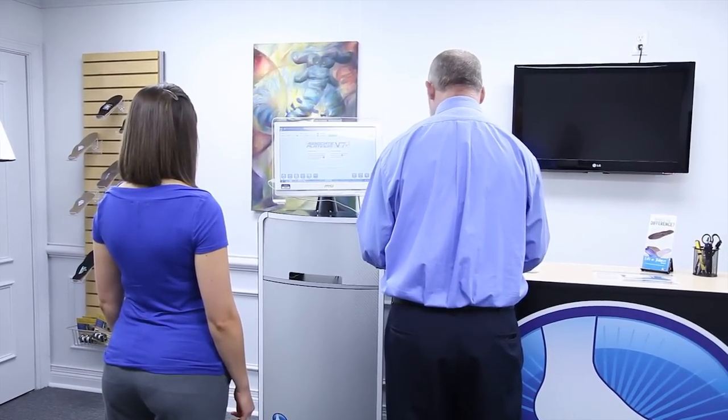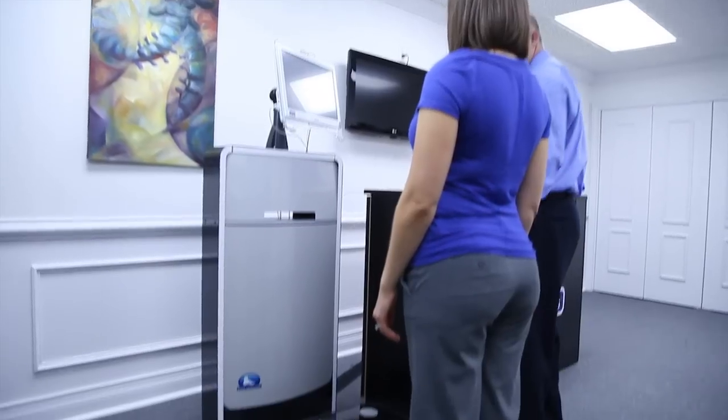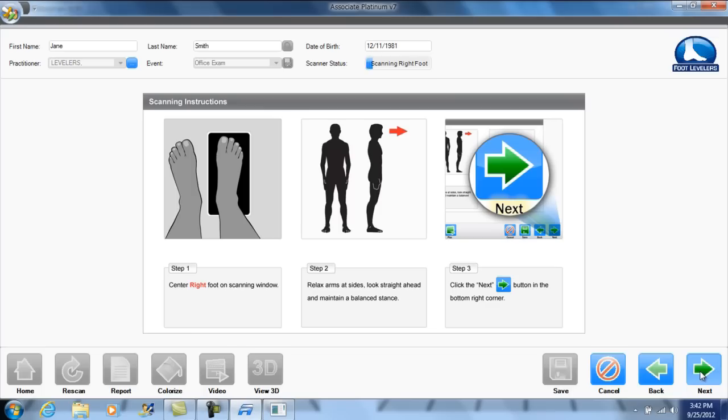3D BodyView requires no warm-up time. The assessment begins directly after entering the patient's name and birth date. During the assessment, an iSafe 635 nanometer laser will capture a 3D image of the patient's feet and the actual arch height of their plantar vault.